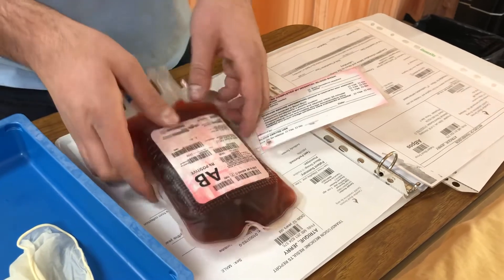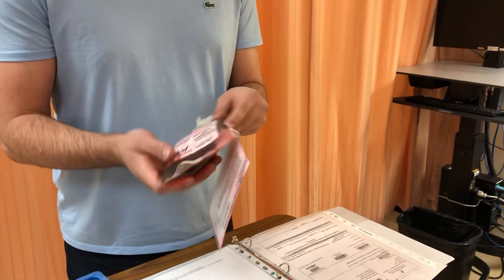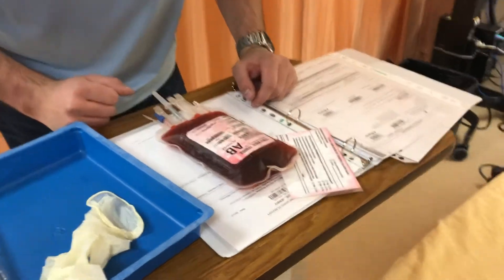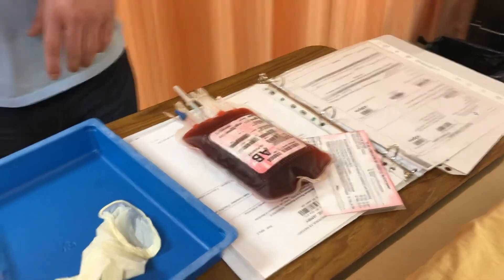I can take a look at the contents of the bag. The integrity of the bag is maintained — there are no clots, it's unopened. Blood looks good.